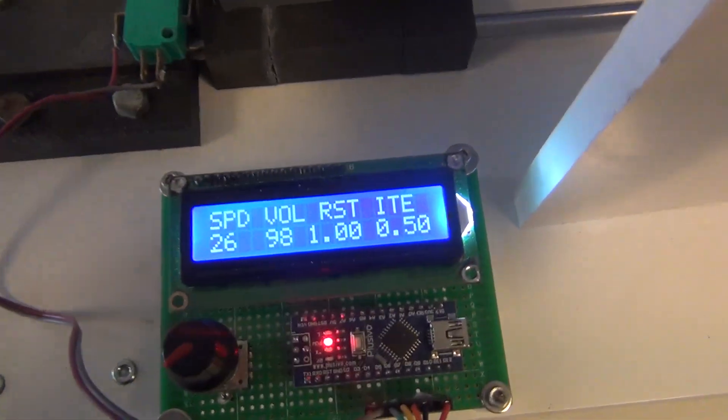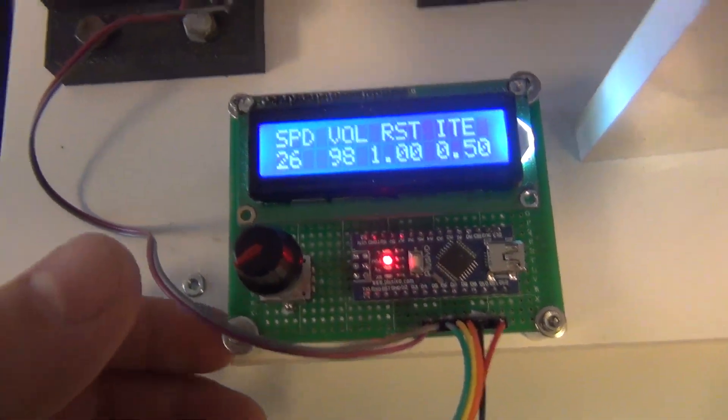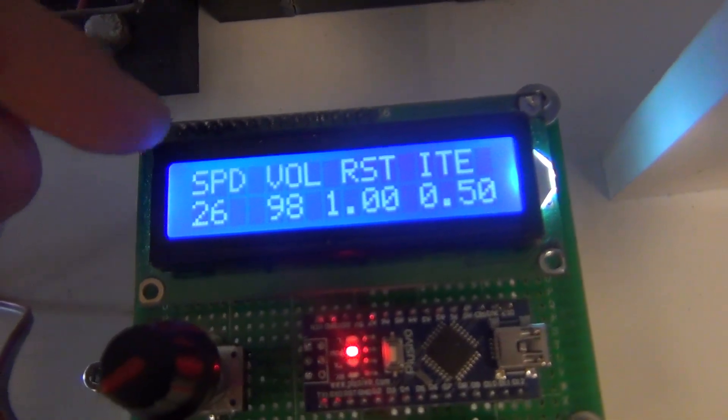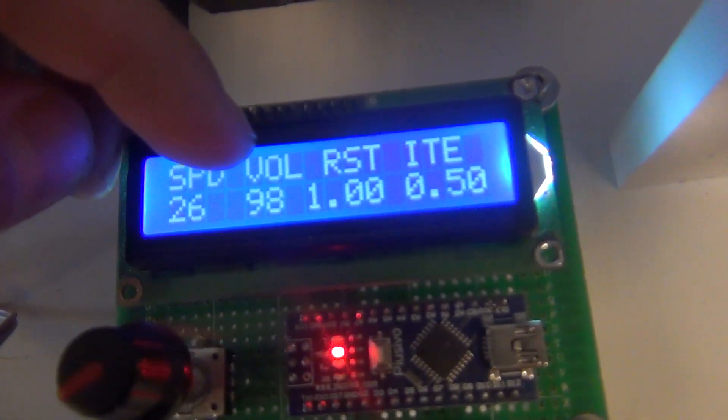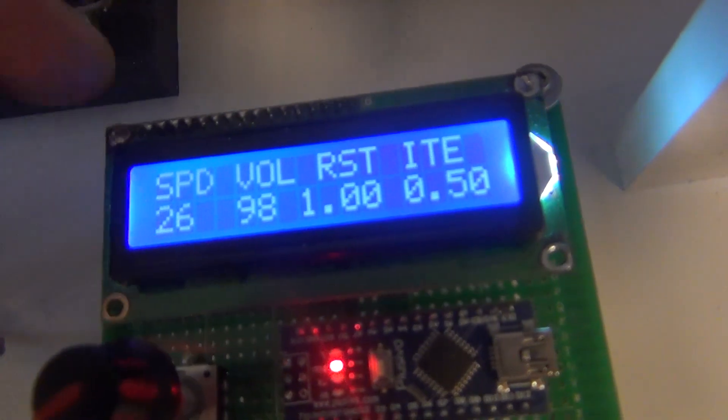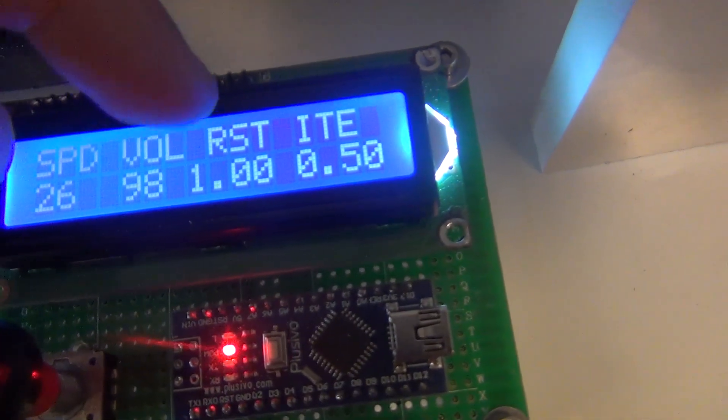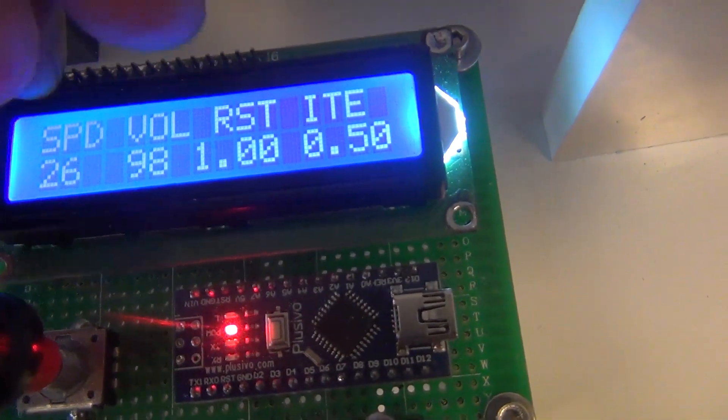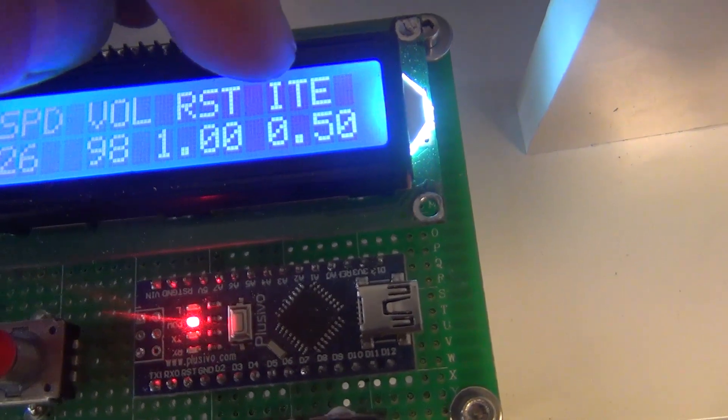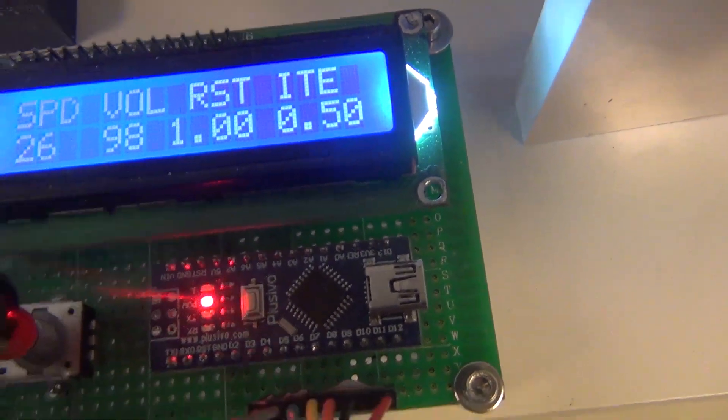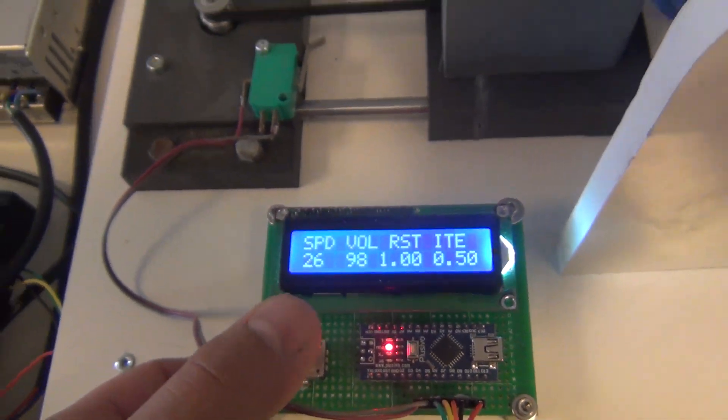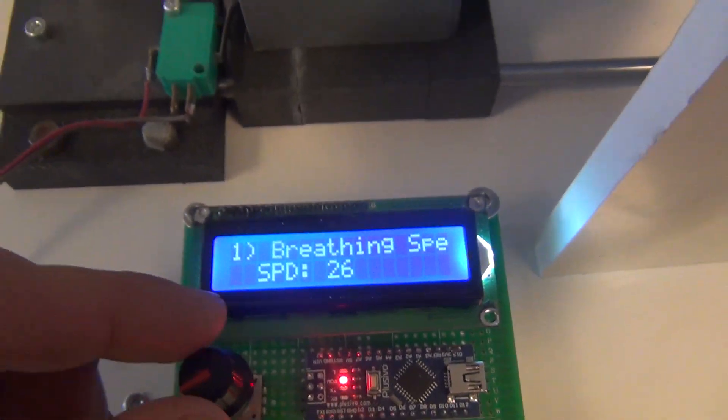So let's go into the software a bit and see what we have here. We have the breathing speed here. We have the volume of air and it's in percentage of the movement. You have the rest period between respiration, so it's one second at the moment, and the interval to wait for the exhale.